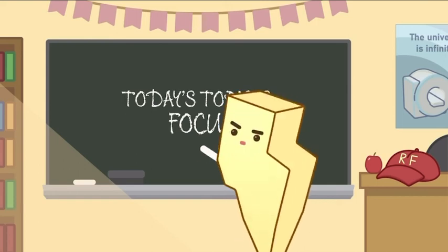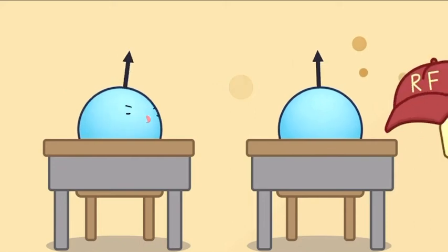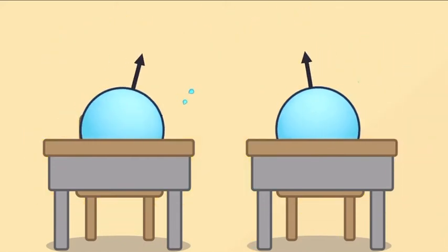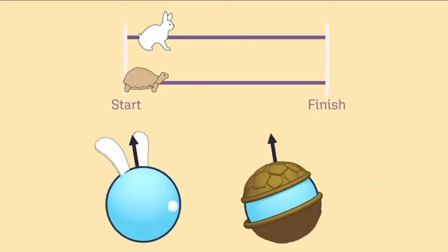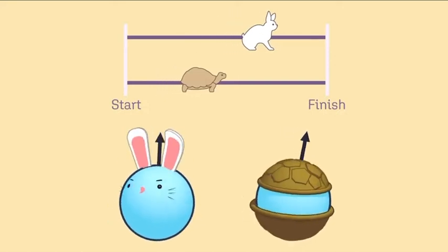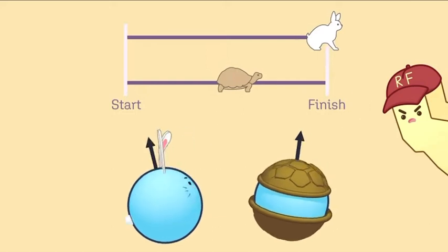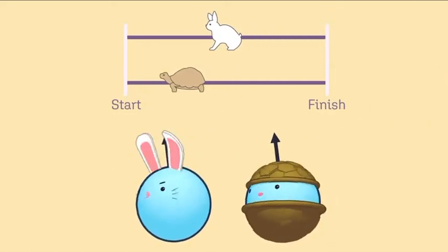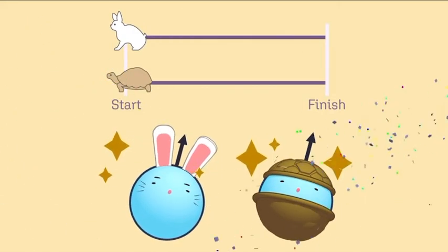As some protons lag behind their faster counterparts, we can apply a 180-degree refocusing RF pulse that instructs all of the protons to turn around and precess in the opposite direction. Much like the classic tale of the tortoise and the hare, though the tortoise is far behind the rabbit, if we ask both to turn around and head back to the starting line of the race, they'll catch up to each other and arrive at the same time due to the differences in their speeds. The crowd goes wild. It's a tie!